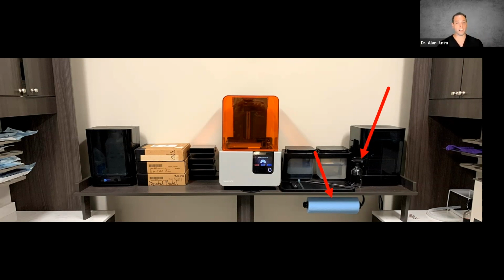The other really important part that I find makes printing more successful for us is making sure that we are able to keep all these tools clean. If you're sloppy, if you don't keep the printer clean, if you don't keep the area clean, if you don't keep your tanks and your cartridges clean, you'll end up with printing errors. So with the right setup, keeping the dirty stuff on the right and the clean stuff on the left, we can clean very well and keep the area clean, and we have much, much fewer issues with failed prints. Primarily, failed prints happen when you get sloppy. So this helps us stay clean and stay like that.